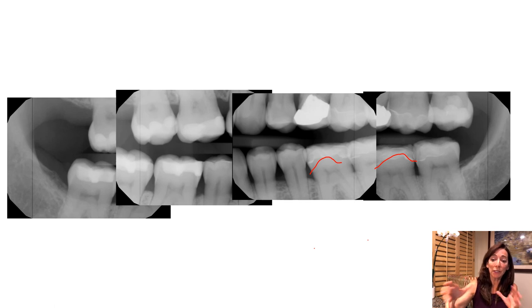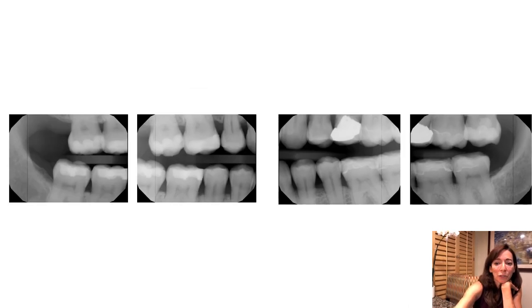If your teacher gets a little tricky and flips some of the images upside down, look for that little curve — that will be a clue for you. The mandibular molars have a very classic molar look, like you see in tooth diagrams. Whereas the maxillary molars are different — the mandibular molars have that characteristic shape that people draw when they diagram a tooth.